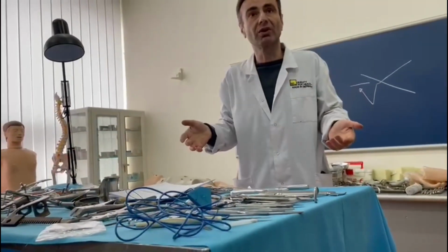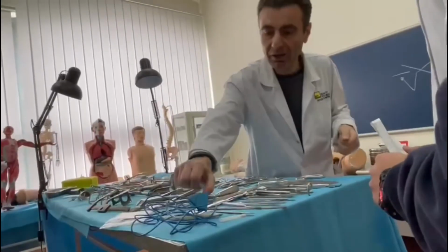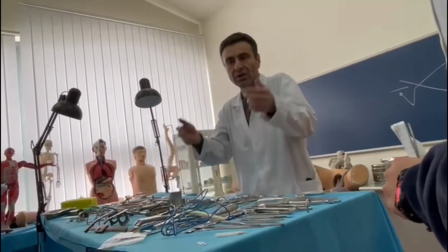That is very simple. To arrest the bleeding, I can ligate these vessels. I can suture these vessels. I can make coagulation of these vessels. I can apply a hemostatic sponge and arrest the bleeding. So there are different methods.